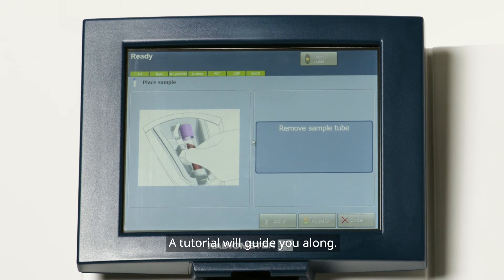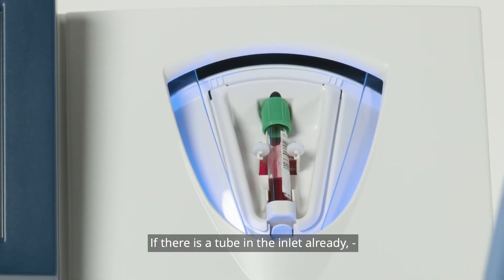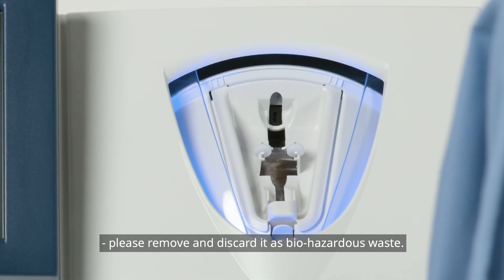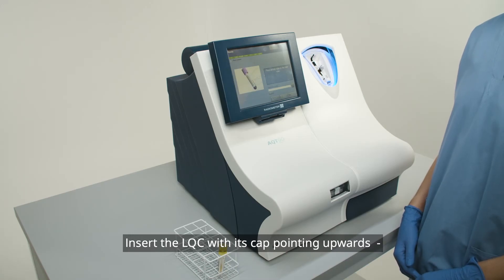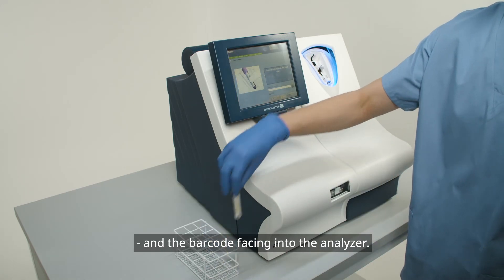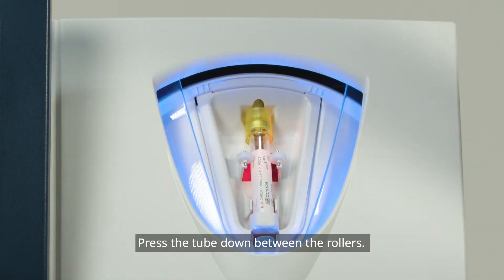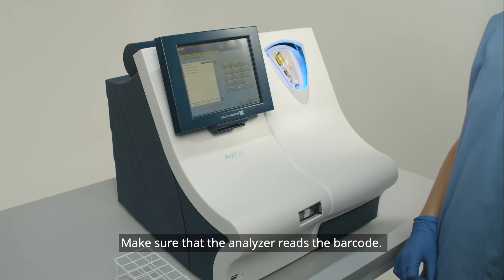A tutorial will guide you along. If there is a tube in the inlet already, please remove and discard it as biohazardous waste. Insert the LQC with its cap pointing upwards and the barcode facing into the analyzer. Press the tube down between the rollers. Make sure that the analyzer reads the barcode.